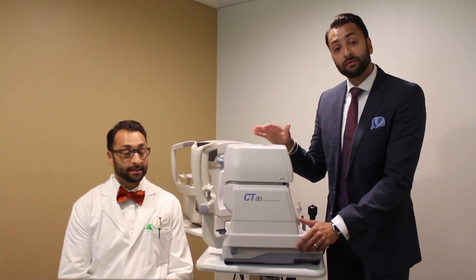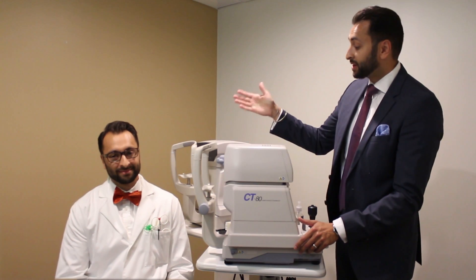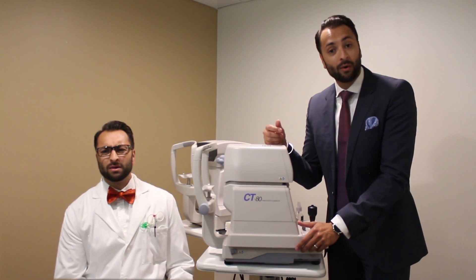This device is called a non-contact tonometer. Tonometry is the measurement of the pressure in our eyes, and non-contact means it doesn't touch your eyes — hence the puff of air. The way it works is the air bounces off the surface of our eyes and back to the machine. The faster the air bounces back, the higher the pressure in our eyes. So Dr. Einstein is going to be our little guinea pig here so we can see exactly how it works.